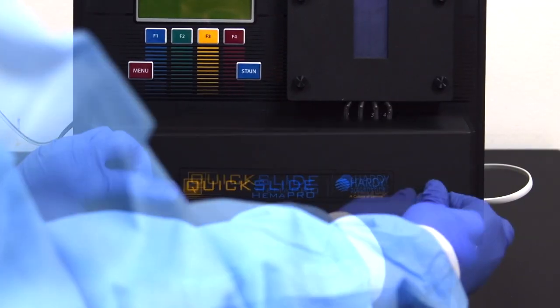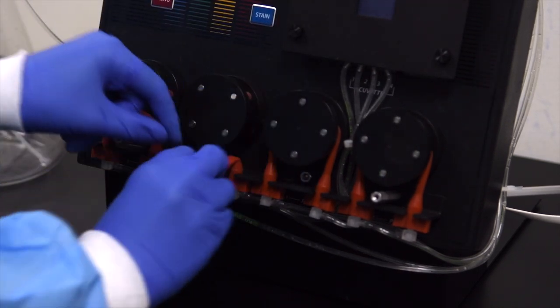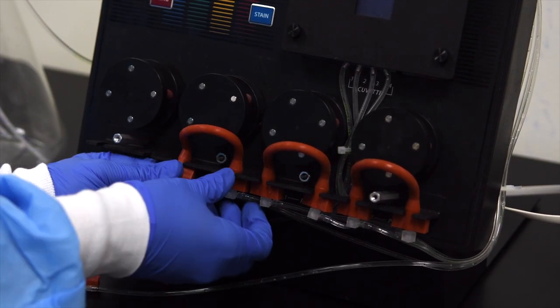Remove the front panel. Stretch the old orange pump tubes off of the rollers. Next, remove the pump tubes from the brackets.